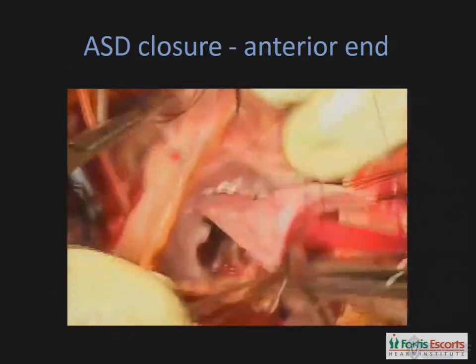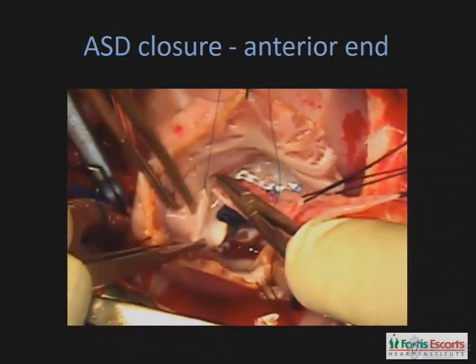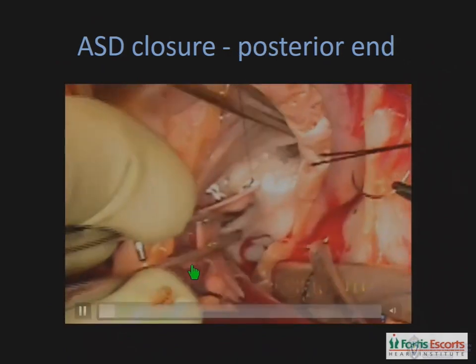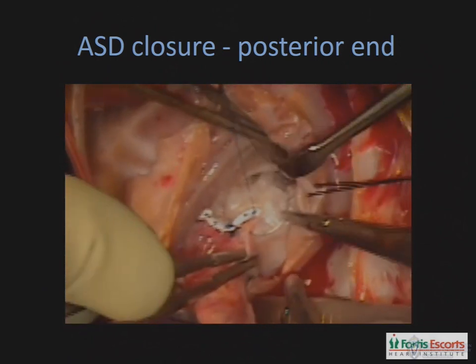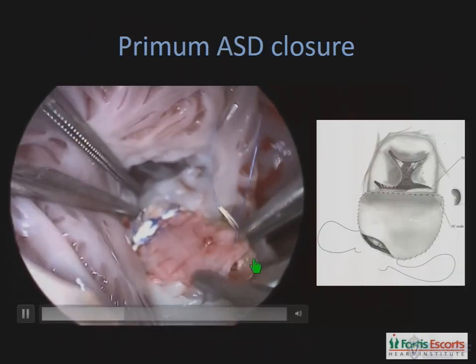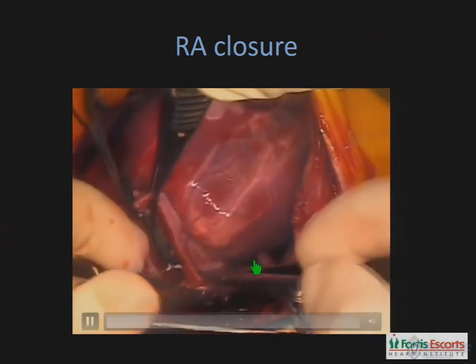Then we move on to the closure of the primum ASD. We start anteriorly — that's the simpler part of the closure — walking along the margin of the ostium primum defect. In this case, the primum defect had been enlarged in order to get better access to the mitral valve. Then we move on to the posterior aspect, where we run medial. My technique is to go on to the base of the mitral leaflet in order to avoid the bundle, which is likely to be in this area — walking medial to the bundle and thereby avoiding injury to it. We complete the closure of the atrial septal defect, then de-air and release the cross clamp.